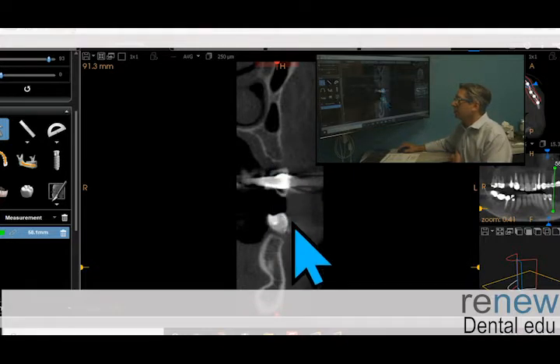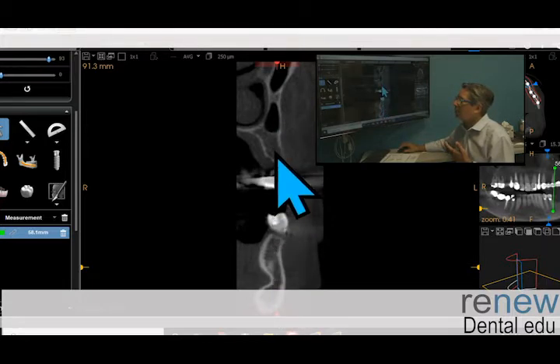That also means, look at down here. You can even compare it to the lower. Here you see some medullary bone, and this is this crazy shelf that we've got of a constriction right by the nerve on the bottom area. So that's another nutty area to be warned about. So I don't have much of constriction here, but I have this crazy constriction here. So that's why I gave it a yellow. I'm not worried about this because I'm not thinking about an implant here, but I am here, so I'm okay with the yellow idea on the constriction because it's not site-specific on my little chart.